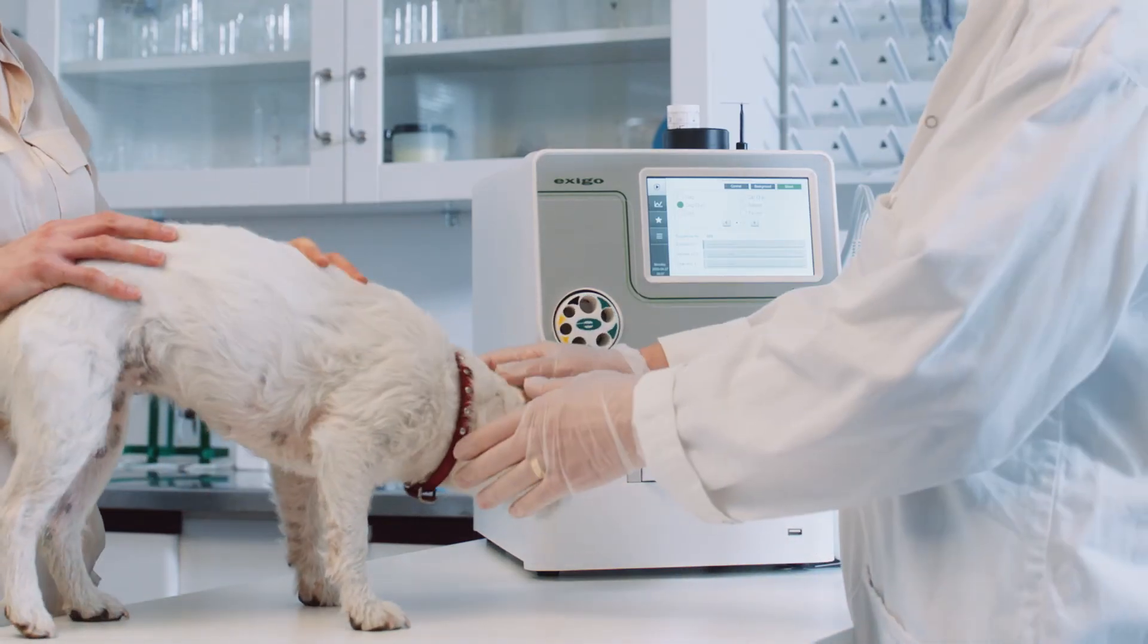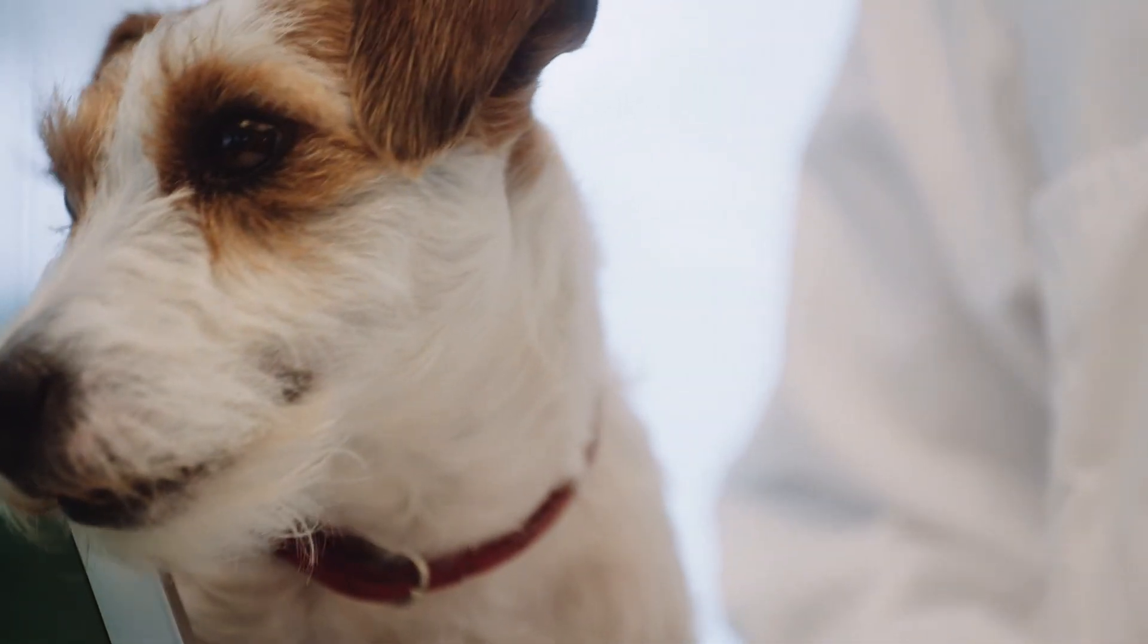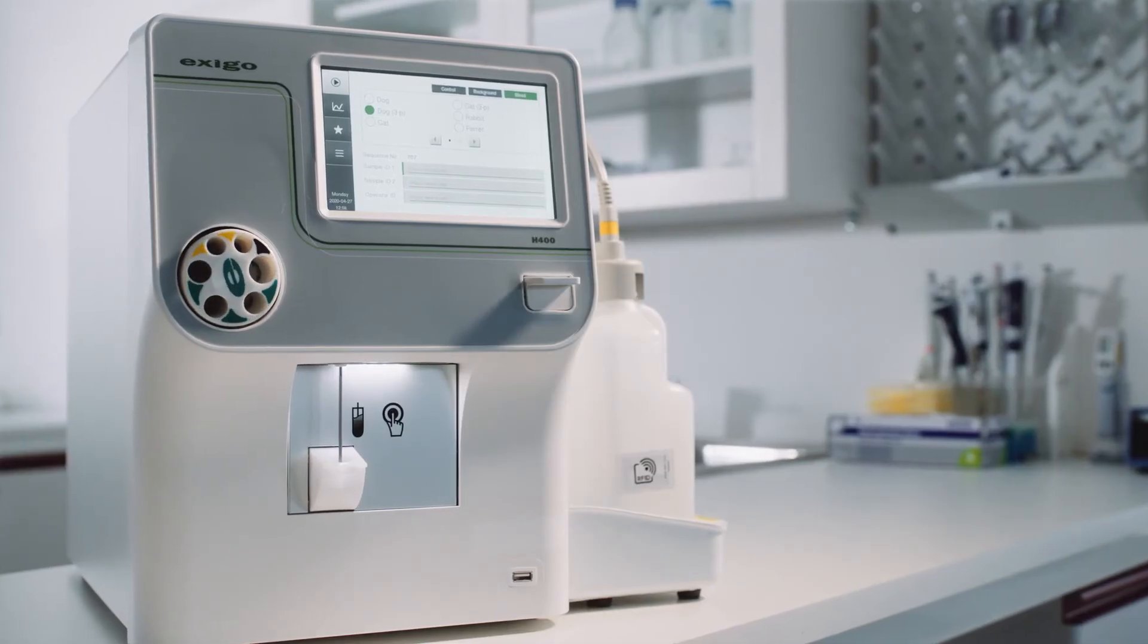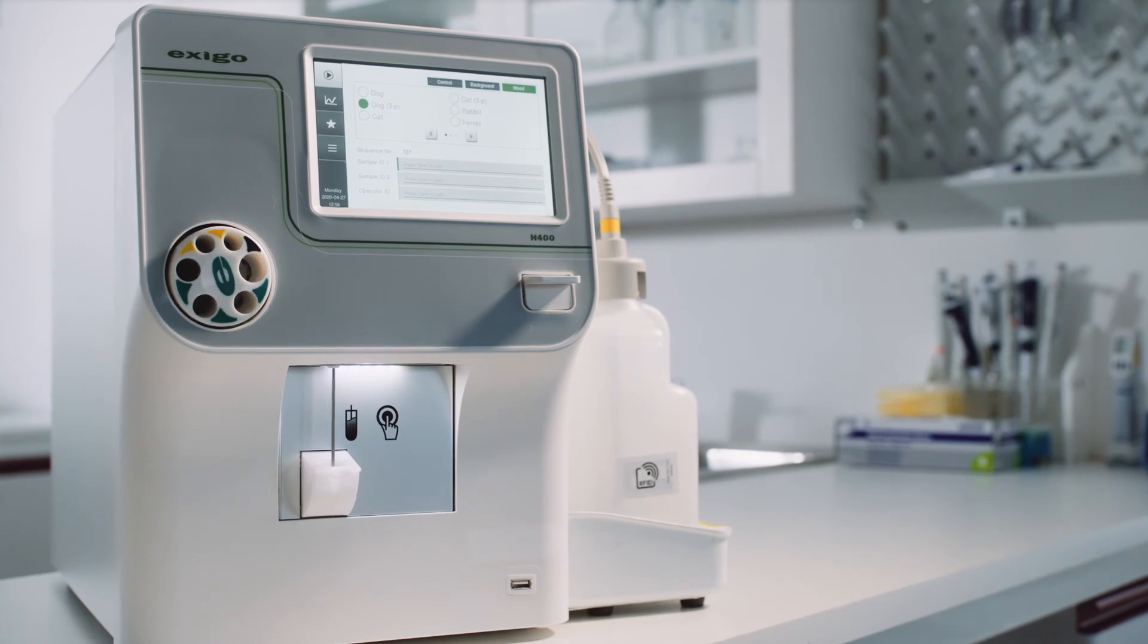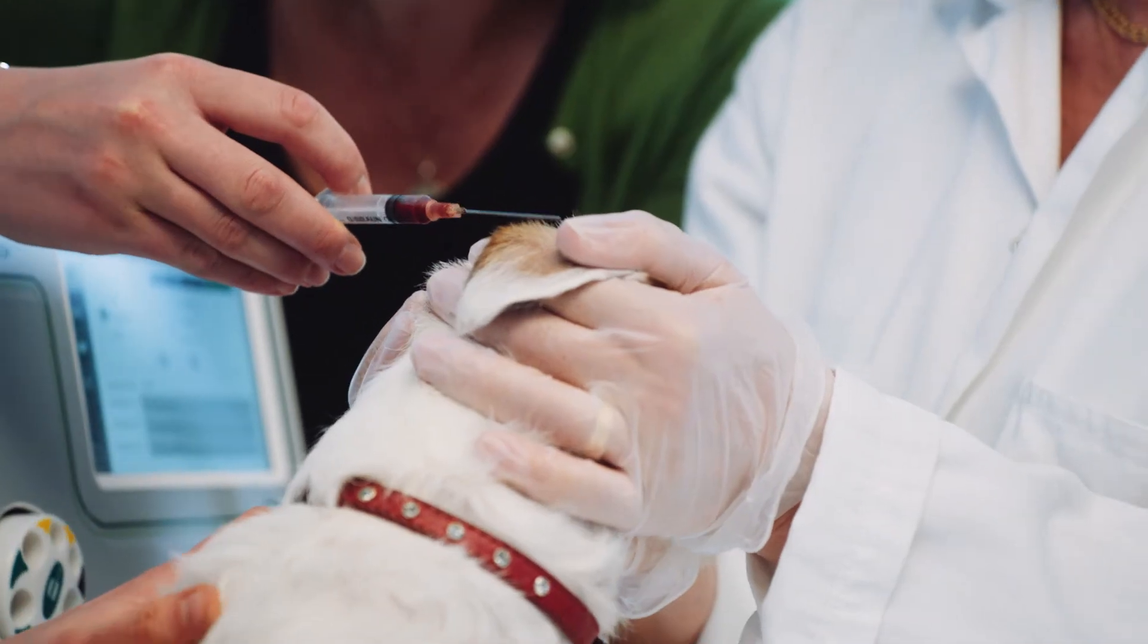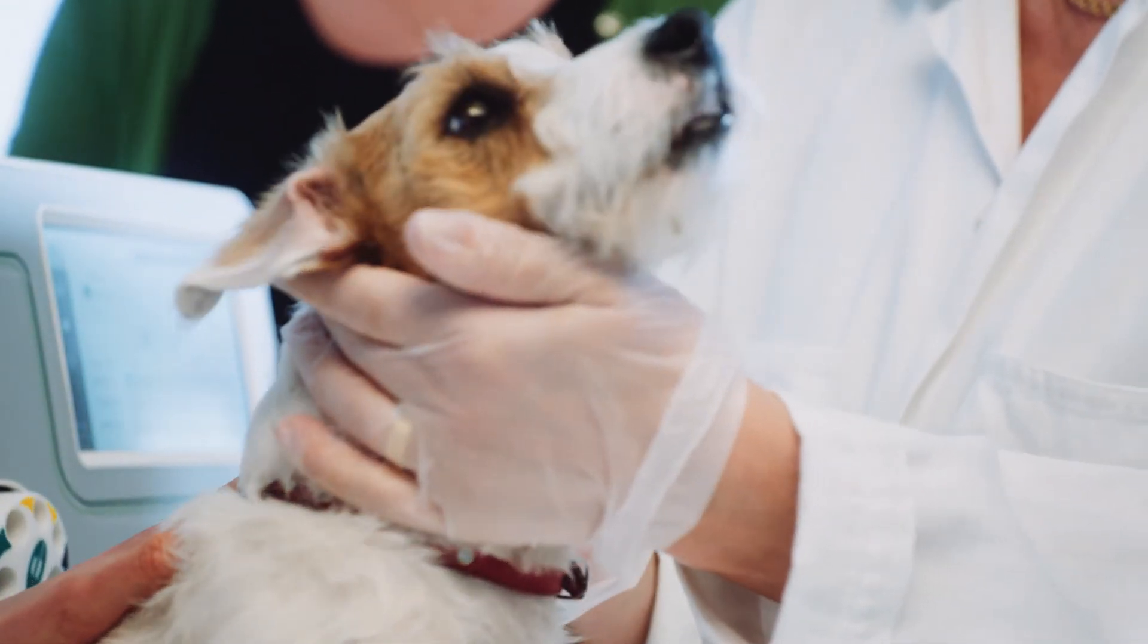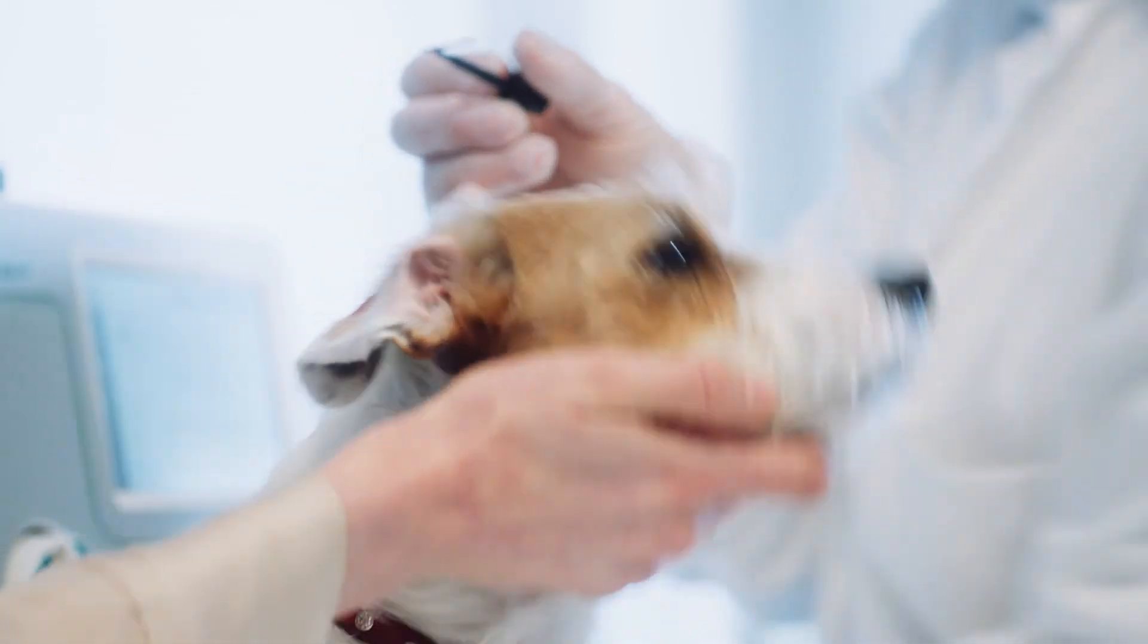This makes it especially suited for kittens, puppies and other small animals or for synovial fluid samples. There is no preparation required, no pre-dilution, no vacuum tubes and no needles. Either one drop of blood can be collected into Bull's EDTA capillaries straight from a cannula or through a less stressful and invasive sample method straight from the ear.